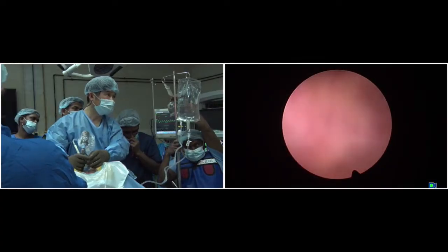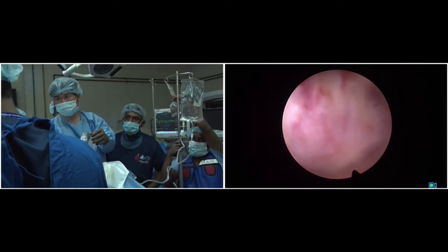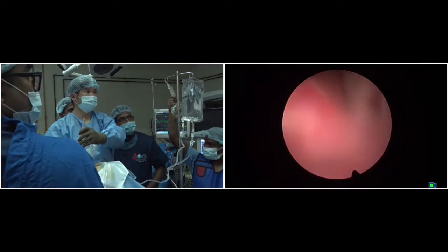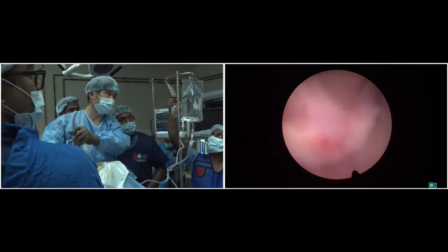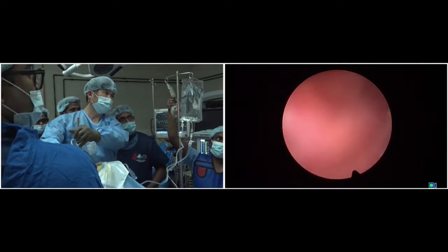Probe. First probe come. Okay. Here is actually here. The ruptured disc may be located here, around here. But so bleeding.